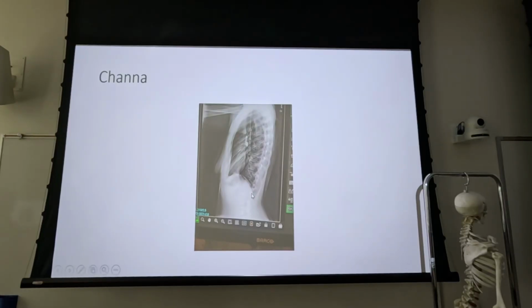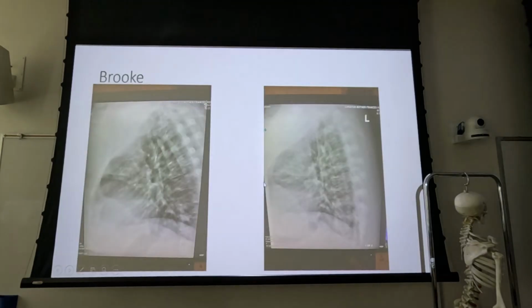So, you know, this is another one of those that there's just not a whole lot that's really good with this image. It's kind of a bad image. So once in a while you run across a patient that is so barrel chested, and I'm not talking about hypersthenic versus asthenic. You've seen these people that just got these great big thick barrel chests, and you might not be able to fit them on an image.